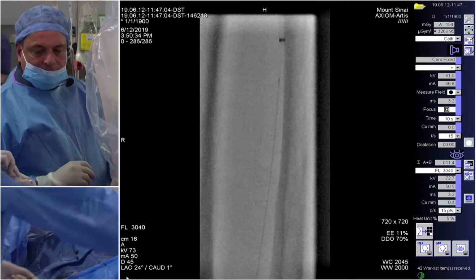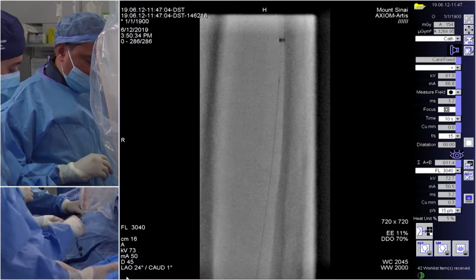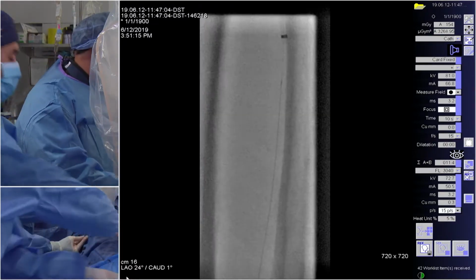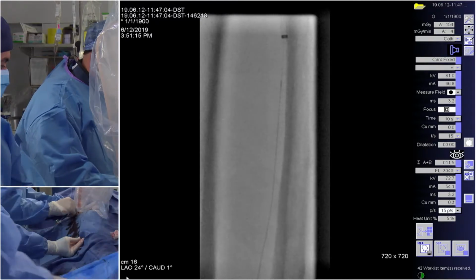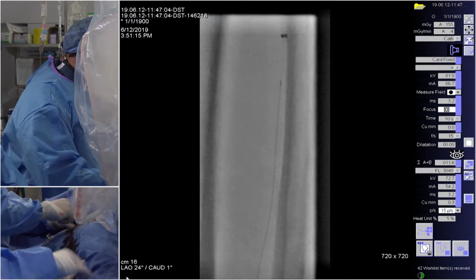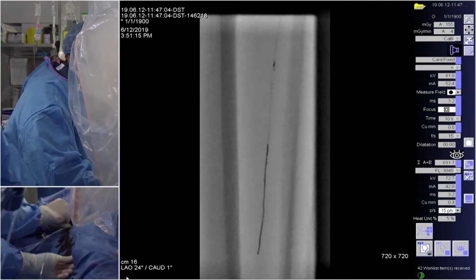I want to ask you, PK, though. Obviously, your team is very efficient and you're very skilled in doing this. And something that we did not even mention is the fact that you're very comfortable ballooning without IVUSing or confirming with intravascular ultrasound. And part of it obviously is your experience, because of the way the wire behaved. Can you comment a little bit on that more? Why are you comfortable saying, okay, I'm not outside the vessel, I'm not subadventitial? Is it just simply because of the way the wire behaved?